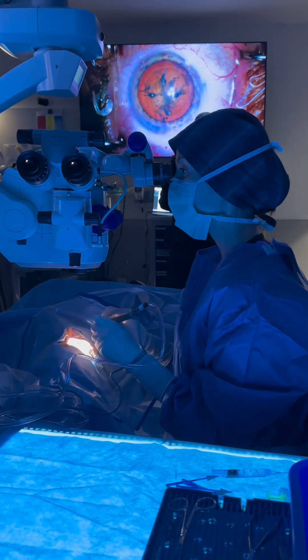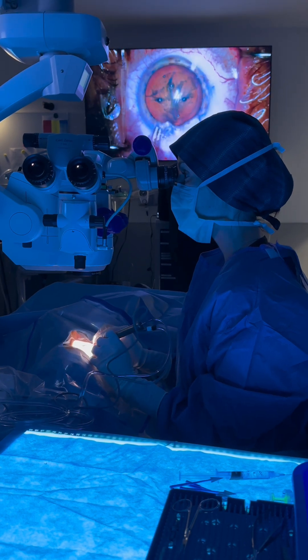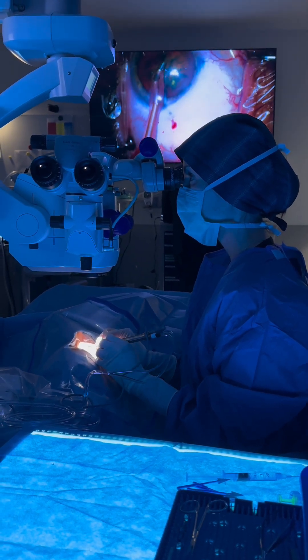This is the ultrasound, or the phacoemulsification, and what this is going to do is further break up the cataract and then remove it from the eye.